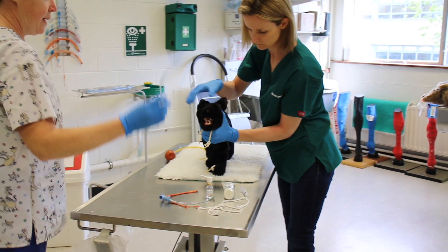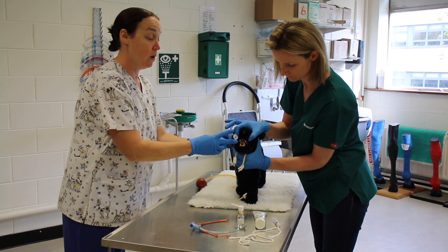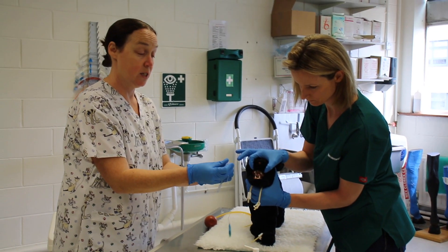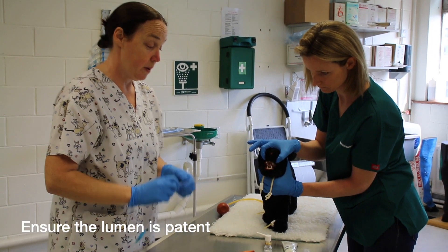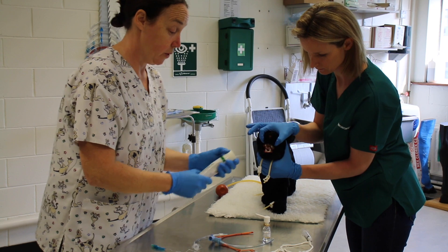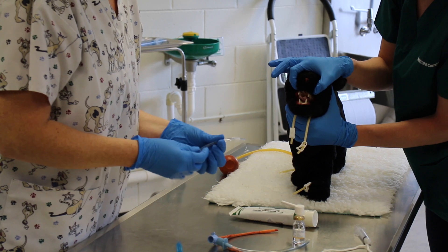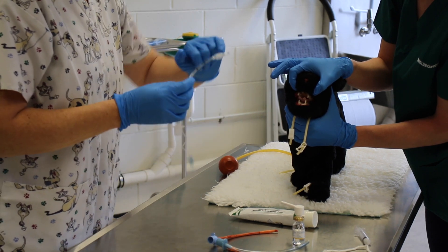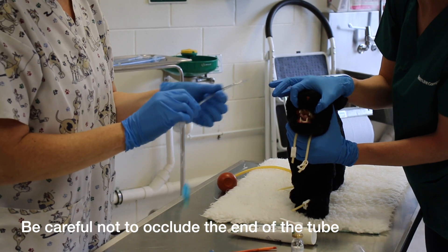I need to measure the length of the ET tube — it goes from the nostrils to the manubrium. If it's too long, cut it and reattach the connector. Make sure your tube is patent. I'm going to lubricate the tube — but not too much, because the lube can block the end of the tube and the patient won't receive any gas.